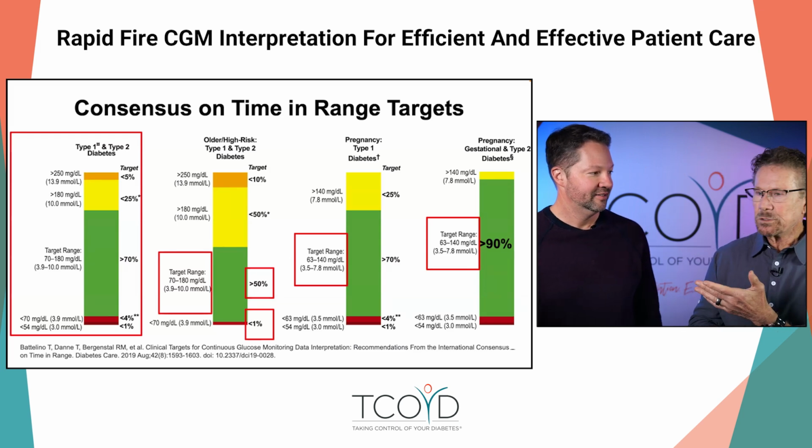I like 70 to 180. When is your commentary coming out in Diabetes Care? It should be any day now. Maybe when this airs. Jeremy wrote a nice commentary on that.